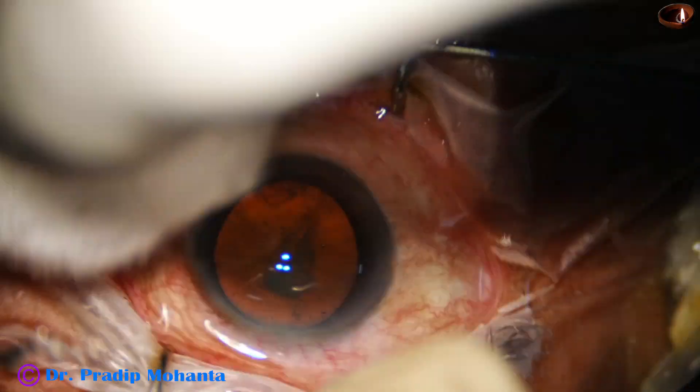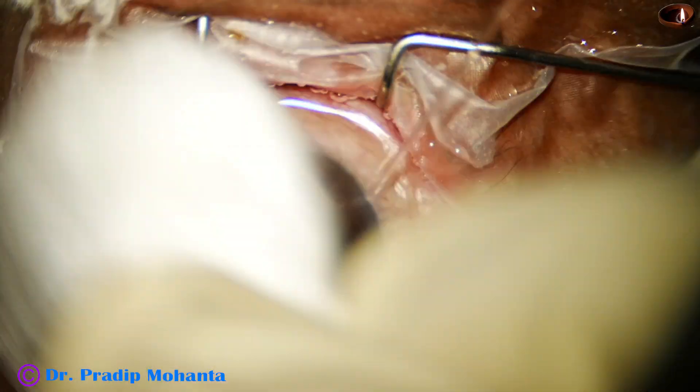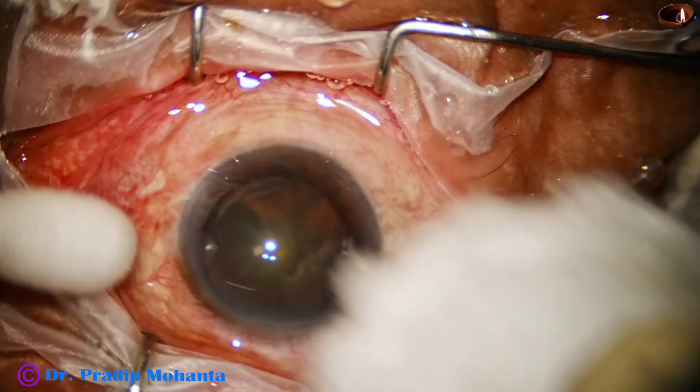The ocular surface is thoroughly irrigated after applying a few drops of povidone iodine 5%. And now, main incision.